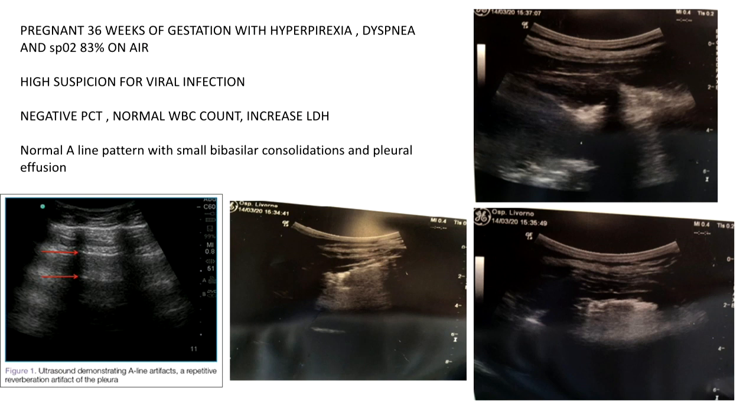We were not in a safe situation, but we can see how lung ultrasound, without performing a CT scan, can in part rule out a very dangerous pathology in a pregnant woman, in whom you cannot perform X-rays or CT scan. No question, ultrasound is really, really important here.